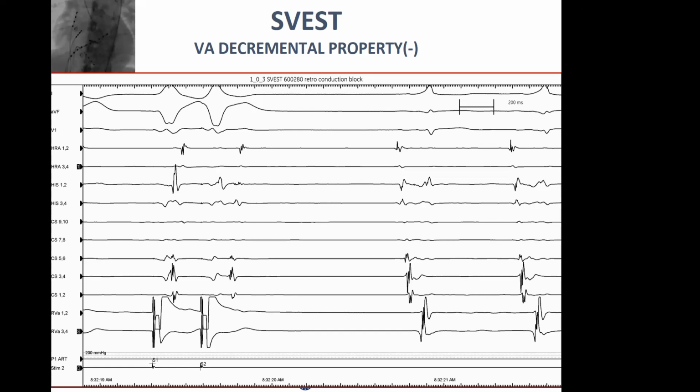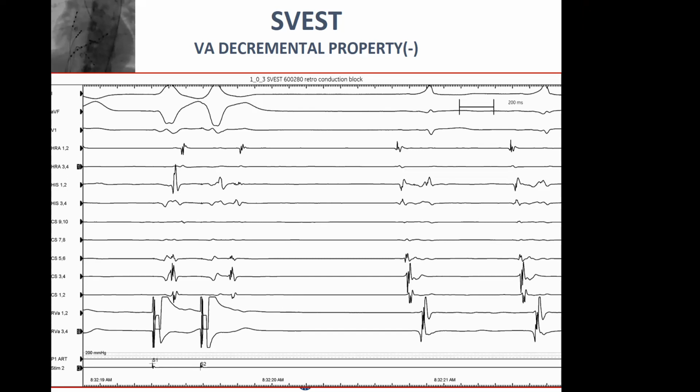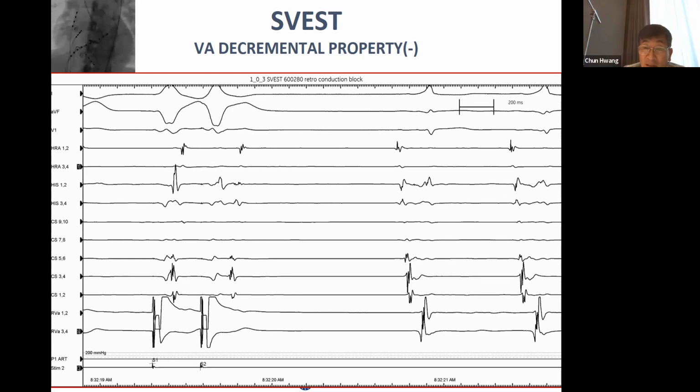이분은 EKG나 EGM에서 점프가 확인된 적은 없었고. Okay, all right. 아니요, 요거는 프로시저에서 보였어요. 아, 이번 세 번째는 저는 있었어요. 있었어? 있었어 없었어? H 점프는 없었고. 아, 제일 마지막. 다 어블레이션 하시고요. 서드 프로시저 끝나고 나서, 성공적으로 어블레이션 하고 나서 점프. Okay, fine.